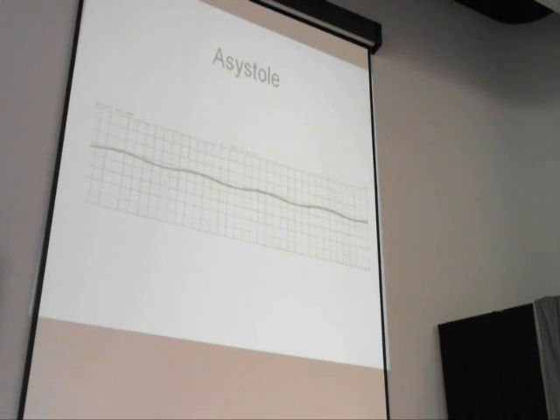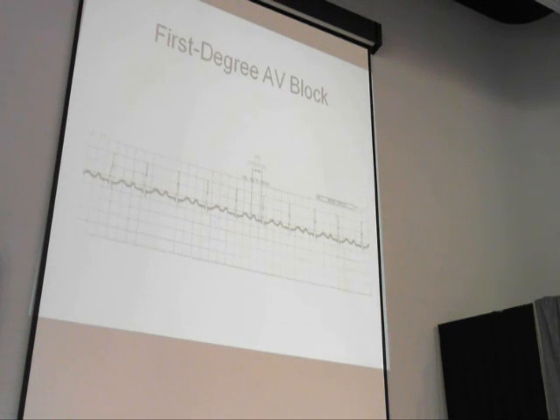And probably with your asystole, this is about like PEA. This is pulseless, more or less. The person's dead, and depending on what caused the asystole, it's usually hard to get somebody back from that. You know on TV when they shock them back into normal rhythm? Is that realistic? No. You can't shock asystole. A lot of it depends on the cause.